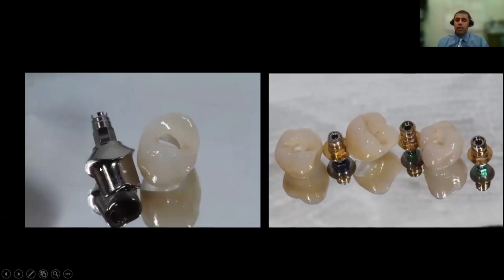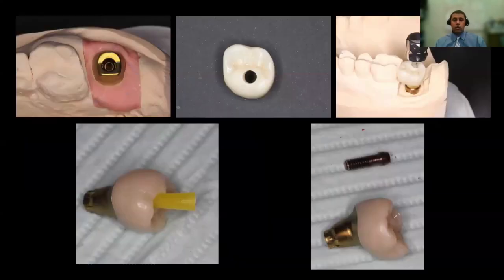You have a wider base and better distribution of the forces to the implant. Now, you can have restoration-level technical complications, things like ceramic chipping and fractures, but you will have fewer complications like screw loosening, abutment fracture, implant fracture, and even bone loss around dental implants long term.